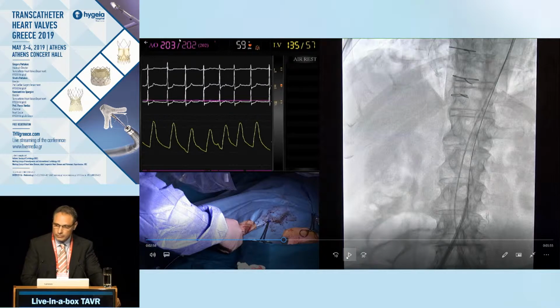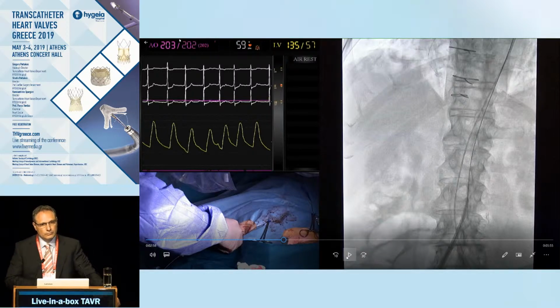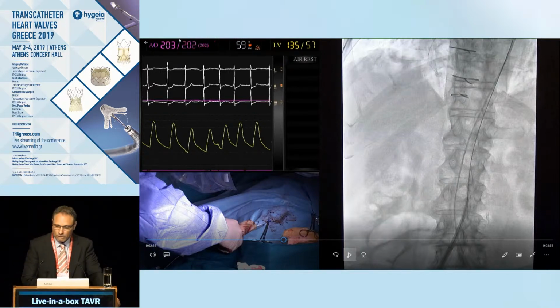Okay, because in the other cases it is easier to find the left carotid from the ascending aorta, so we don't manipulate it in the ostium of the innominate, essentially. Yeah, I understand, but that's what I'm saying, I just want to make clear for whoever is watching that this may be particularly helpful here, but it's not the general way that this device is used.